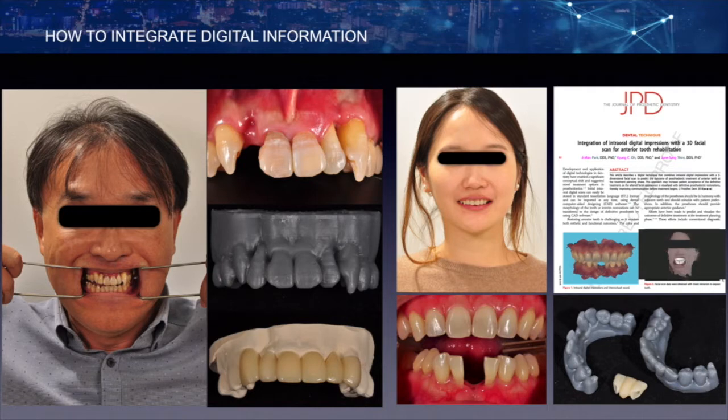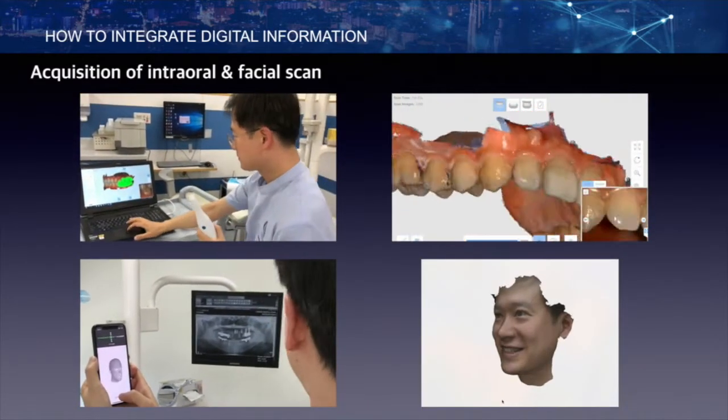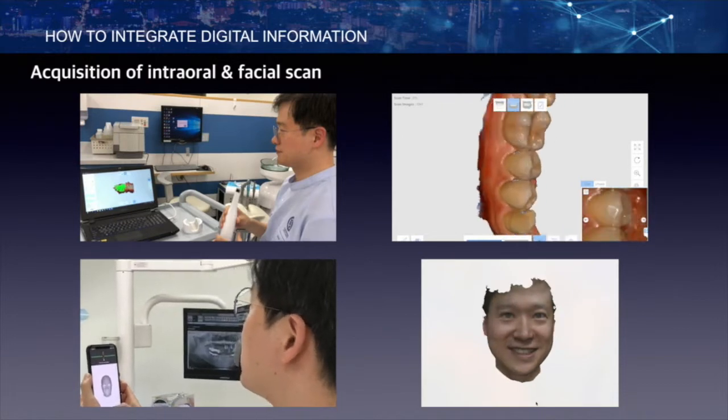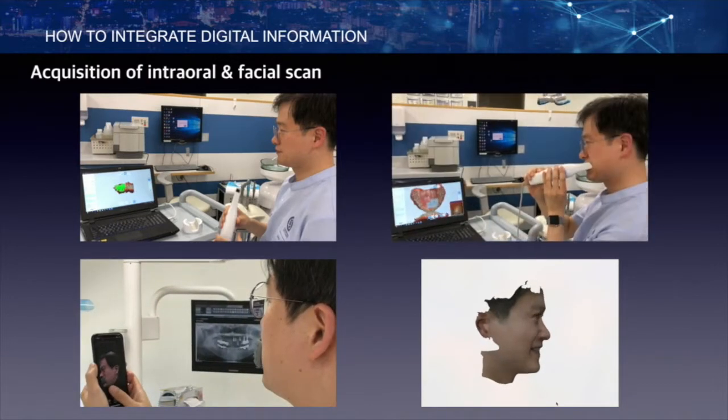I'm also publishing this procedure in journals such as JPD, making this one of the pieces of evidence for digital dentistry. The development of intraoral scanner technology has been rapid, and I can quickly scan my mouth by myself. Recently, we can easily get an excellent facial scan with a brand new smartphone.